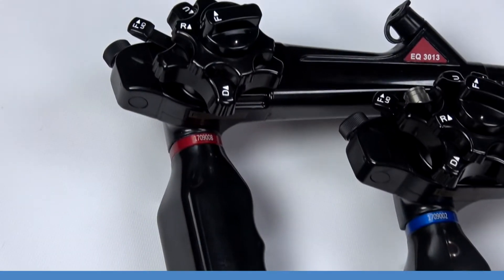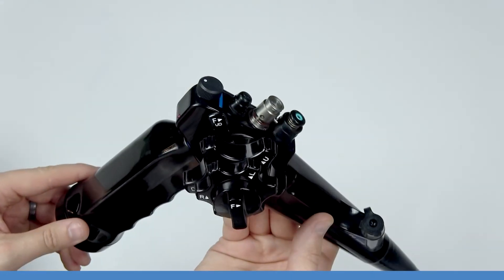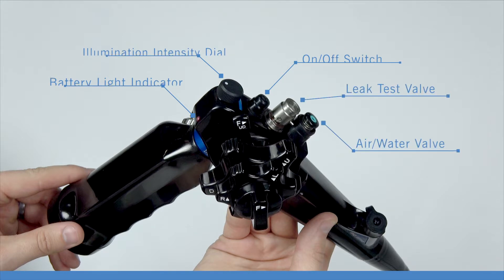Before we get into the specs of each scope, let's go over the basic anatomy. Each control body is the same for both the EndoEye EQ1510 and EQ3013. The control body features your on/off switch, battery light indicator, illumination intensity dial, leak test valve, and air water valve.